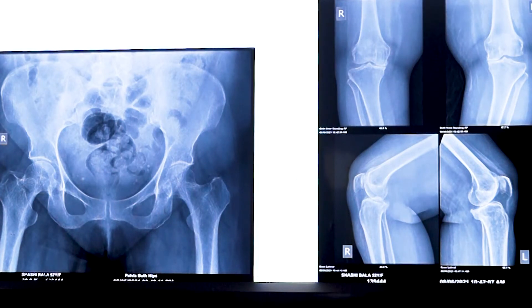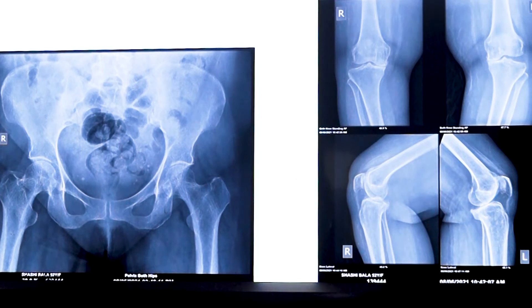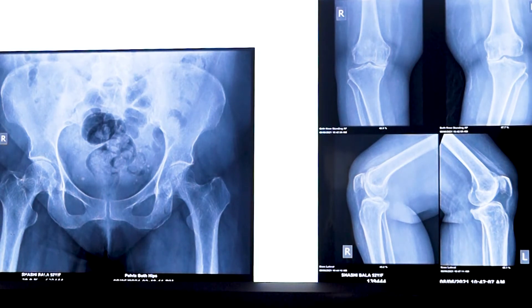We choose the implant depending upon the type and severity of deformity and the type of bone stock. This patient also requested a Johnson & Johnson knee replacement surgery, so she was planned initially for a CR 150 — meaning we wanted to retain the ligament of the knee with a flexion of almost 150 degrees. However, when we went inside, we found that the ligaments were damaged, so we had to convert it to a cruciate-sacrificing knee. In the literature, there is no difference in results between the two.